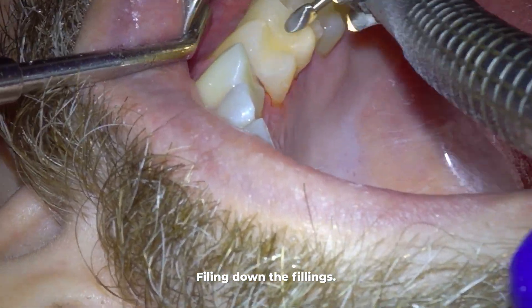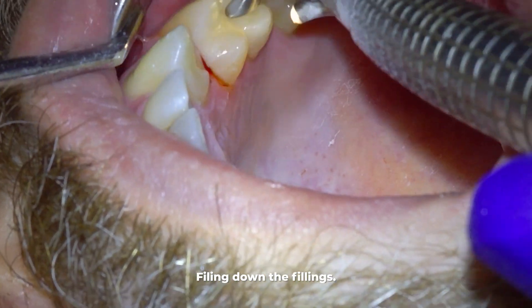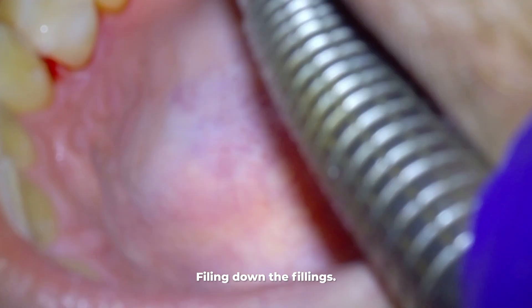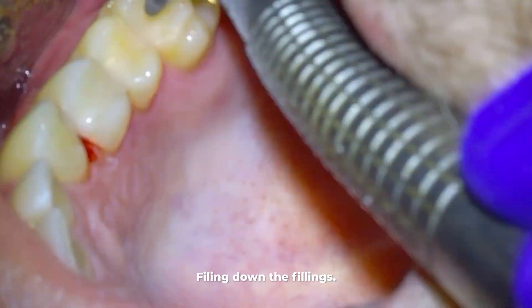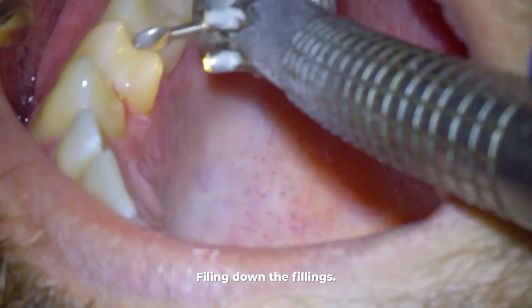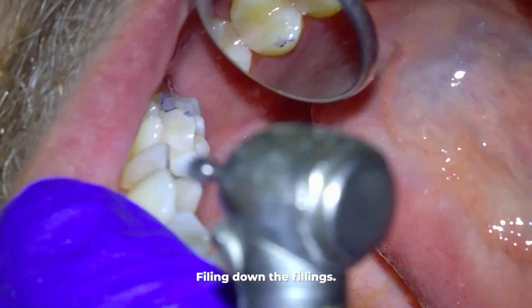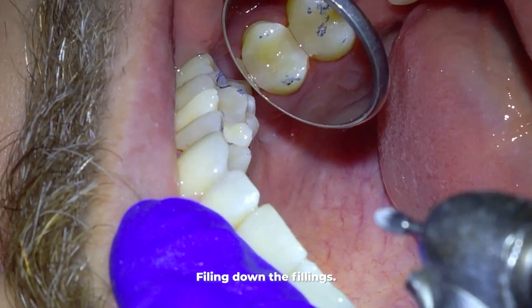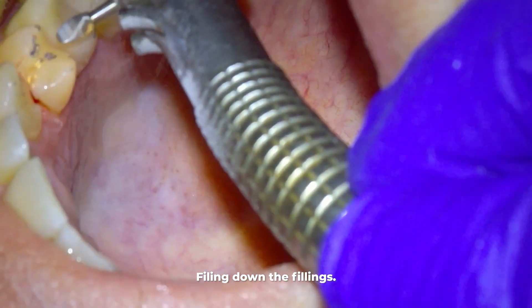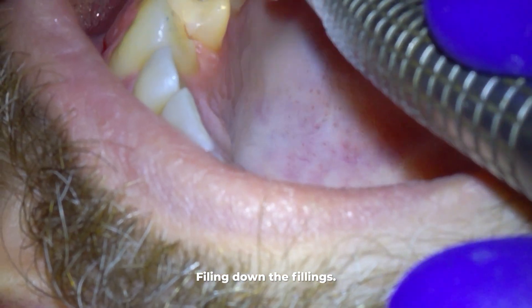I use three things to determine if the bite feels good and even. First, when a patient bites down you can hear when all the teeth touch evenly — that's the least scientific way I check. Second, I ask the patient if it feels even when they bite, however a lot of times people are too numb to determine this accurately. Lastly, I use blue carbon paper to see where the patient is biting down. I like to see barely any blue showing on the filling area, and personally I keep filing until the opposing tooth is barely touching the filling if contacting it at all.